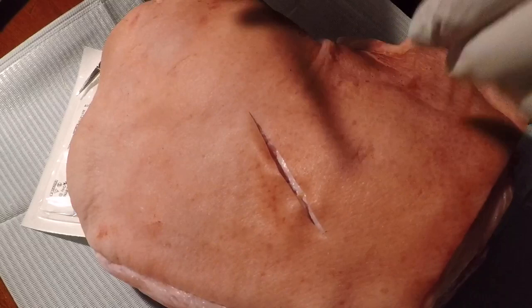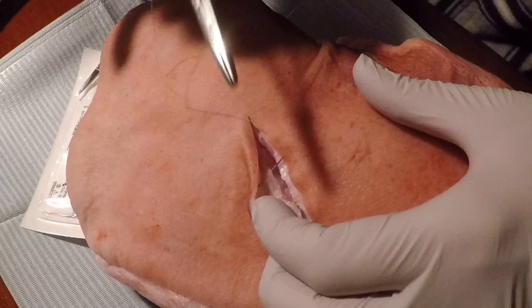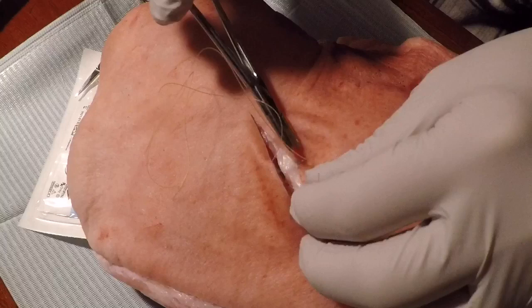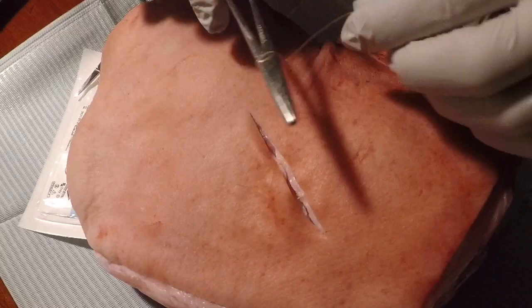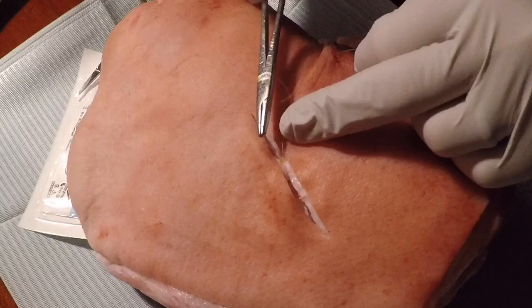We're going to do a couple more deep ones and then do the superficial sutures. Same as before — come in from the bottom, come up, and then over. You want to get nice big bites; if you do it too little, the tissue will actually rip out and your sutures will pull out. Chromic gut lasts a lot longer — about 40 days. Plain gut lasts about two weeks, about 14 days. So if you need the suture to hold for longer, use the chromic. If you only have plain gut on hand, it'll do.